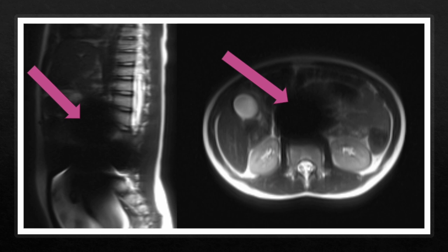Another case study, this was quite recent actually. So again, this is a fast HASTE localizer. This patient was for a brain and a spine. We'd already imaged the brain. Again, no history of any surgery, not had any abdominal problems that we've known of, nothing before we looked on the gown. There's nothing on the gown. There's definitely some susceptibility artifact visible.